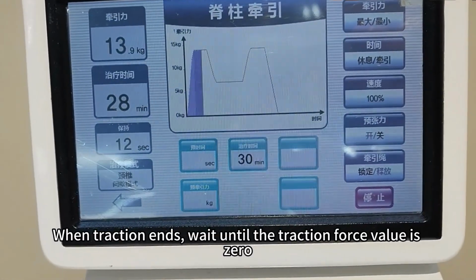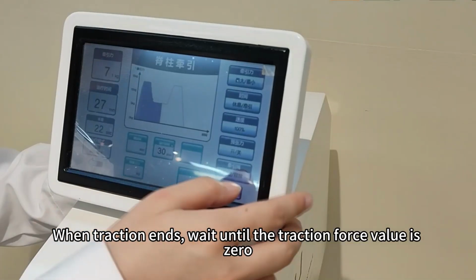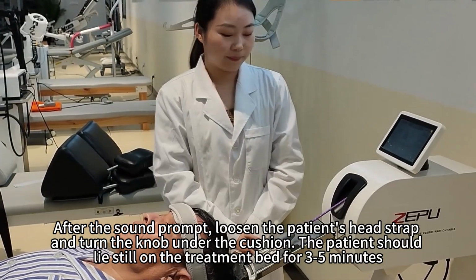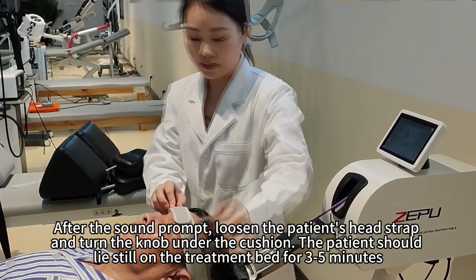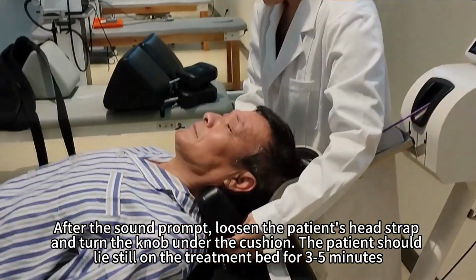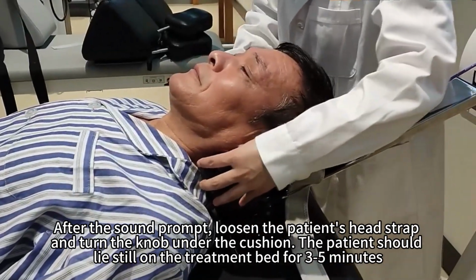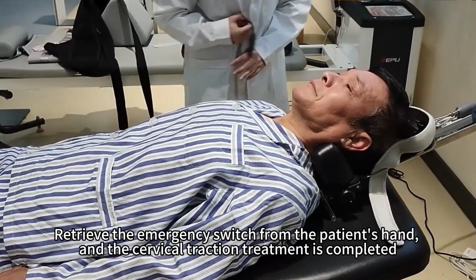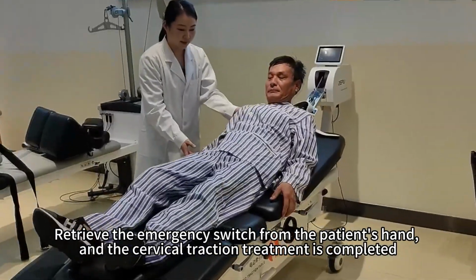When traction ends, wait until the traction force value is 0. After the sound prompt, loosen the patient's head strap and turn the knob under the cushion. The patient should lie still on the treatment bed for 3 to 5 minutes. Retrieve the emergency switch from the patient's hand, and the cervical traction treatment is completed.